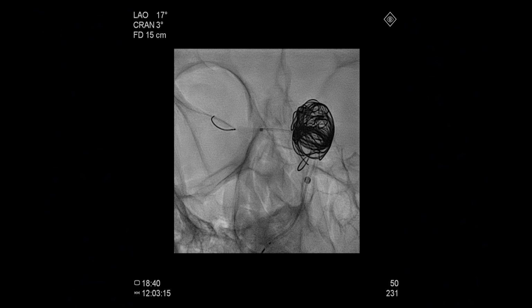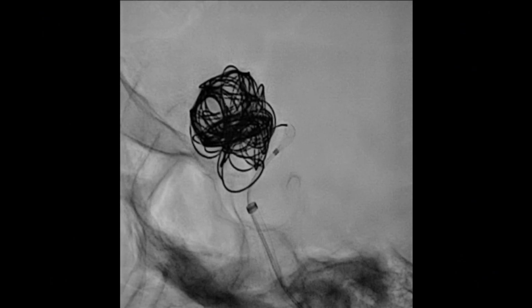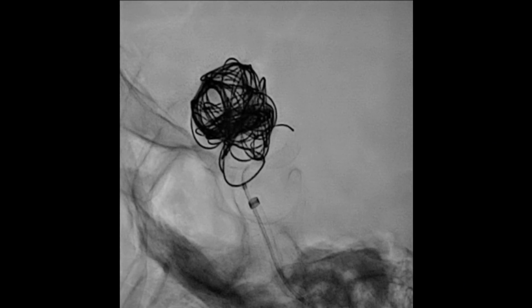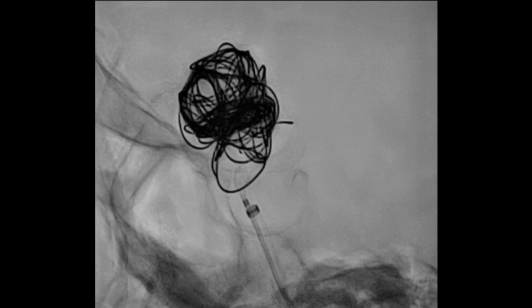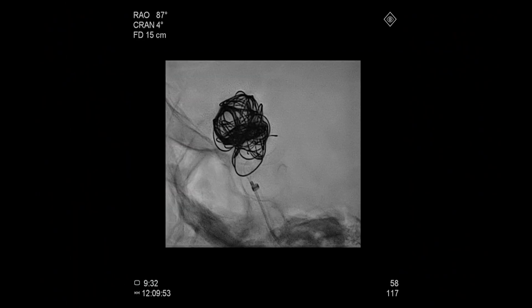The flow diverter was initially deployed in the middle cerebral artery, partially opened up, then dragged back into the ICA bifurcation very carefully, now being deployed. Subtle movements of the microcatheter tip help to open the flow diverter. It opened up well in the aneurysmal segment. Static imaging showing the distal guide helps us in this maneuver.